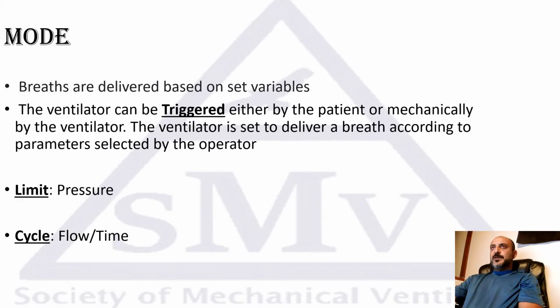So when we define that mode, the problem, like any other mode, is the naming of the modes in different ventilators. Some ventilators call it AC, some call it CMV, some call it VC, AC, VC, which I really do not like. The mode, according to Chatburn's classification, has volume as the control variable, so it's volume controlled, continuous mandatory ventilation.